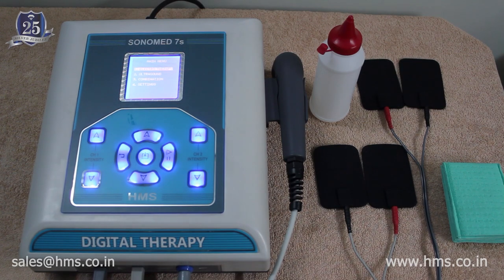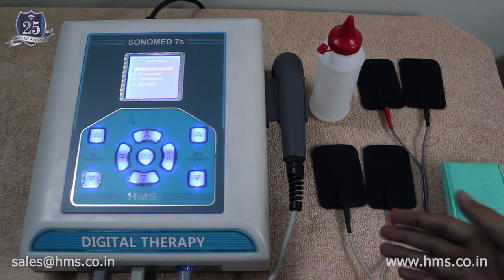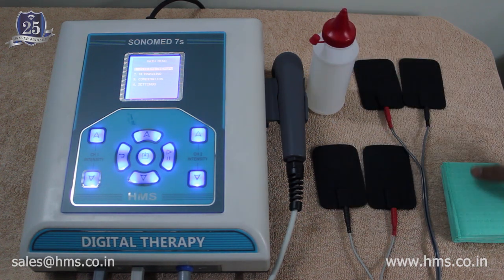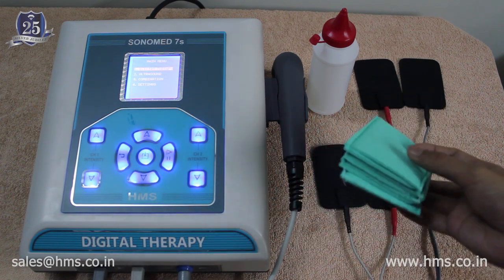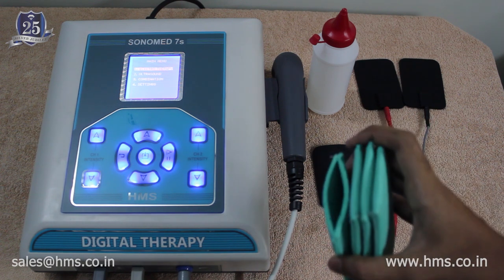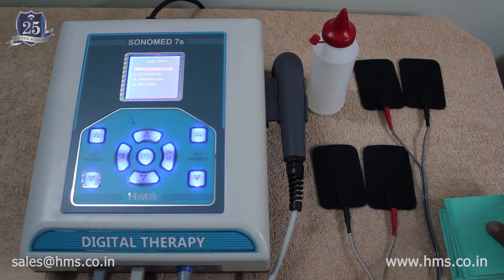The electrodes are connected to the channel 1 and channel 2 pins. There are two methods to connect electrodes to a patient's skin: you can apply gel directly to the electrodes, or wet the provided pouch, insert the electrode into it, and place it on the skin. The second method is equally effective and useful when gel is in short supply, as water is also a good conduction medium.